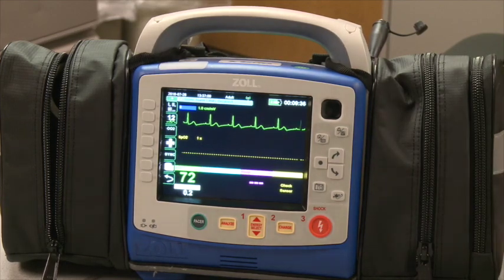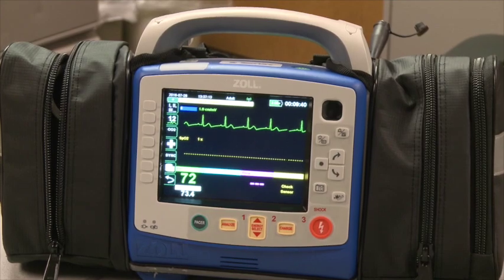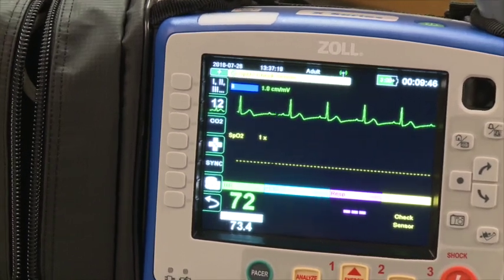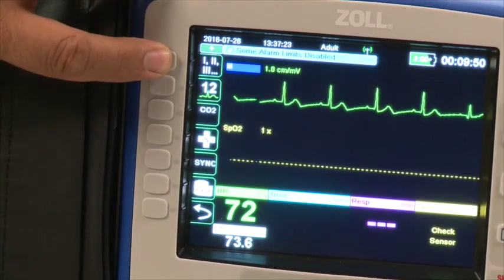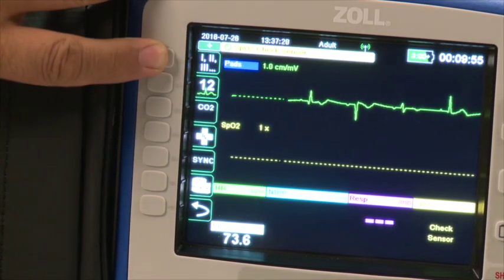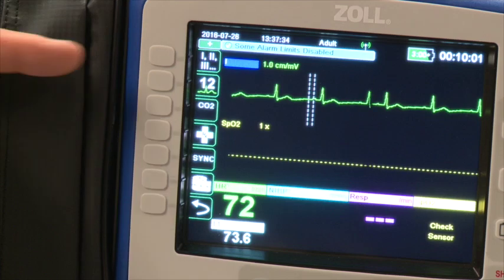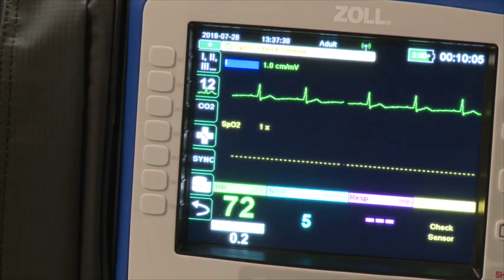Moving to the left-hand side soft keys: the very top soft key scrolls through the leads displayed in the top tracing — lead one, two, three, AVR, AVL, AVF, and pads. The second key down is the 12-lead key. By pressing it, you follow the pictures on the screen — it's a very simple process.